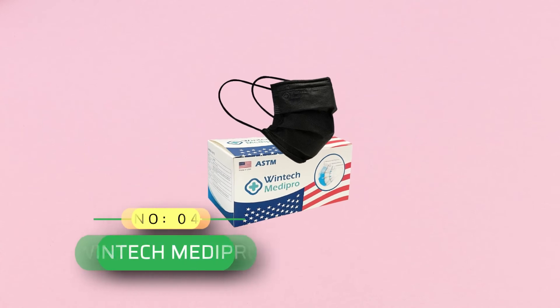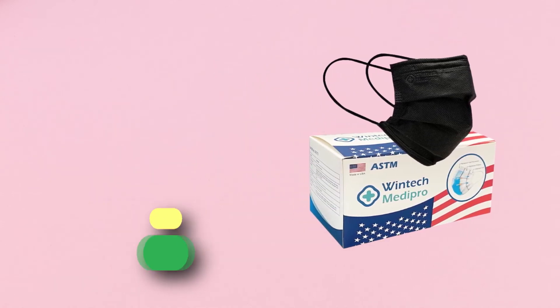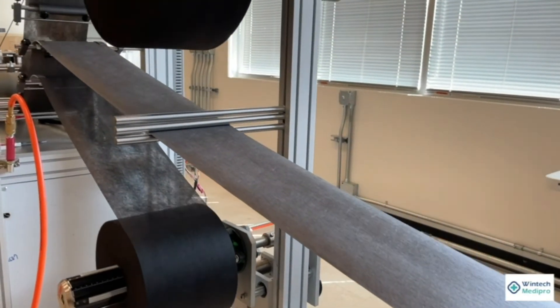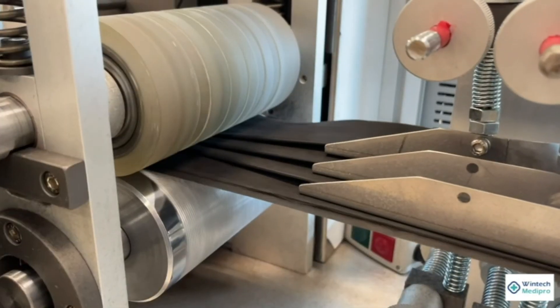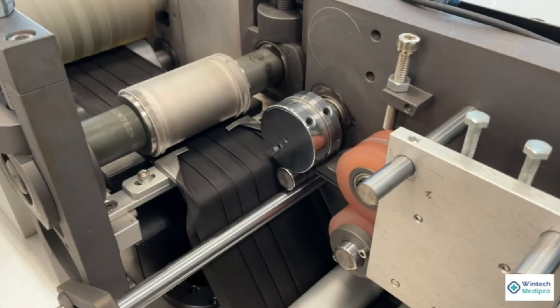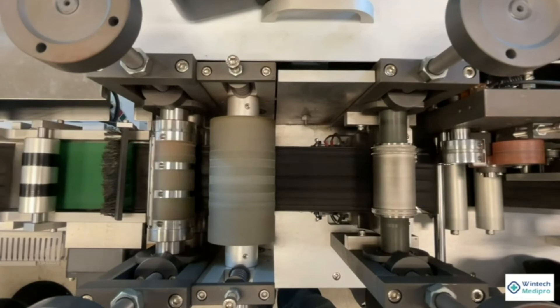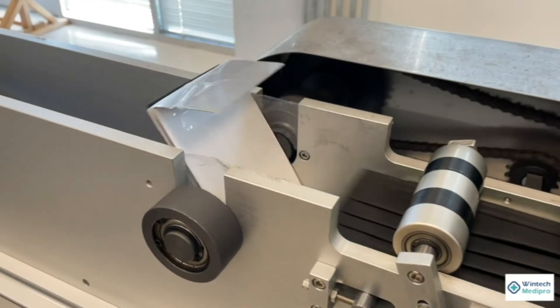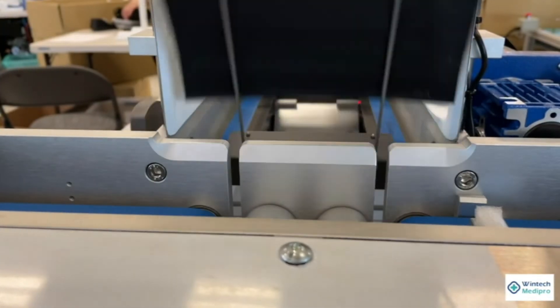Number 4: Wintek Medi Pro ASTM Level 3 Surgical Mask Made in USA. The convenient ear loop design allows you to slip on and remove the mask quickly and easily. The mask is soft and breathable for comfortable wear. The high filter performance and low breathing resistance ensure maximum safety while maintaining maximum wearing comfort.